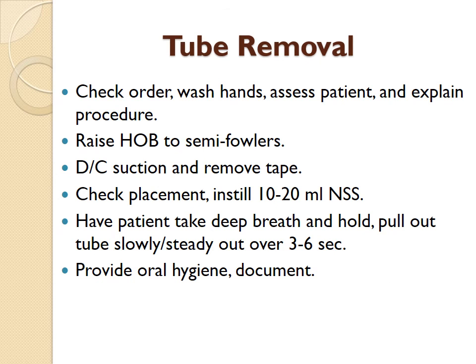Once you guarantee that it is in place, you're going to make sure that you secure it firmly to the patient's nares with that tape to the top of the nose, giving it enough movement so that it is not pulling on the nostril. If you're using a pre-manufactured holder, secure it in place.